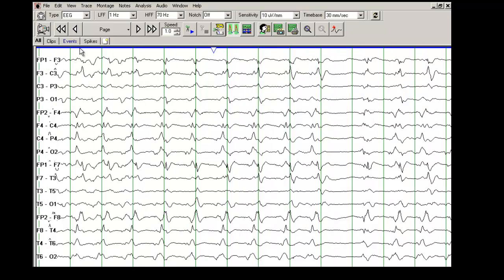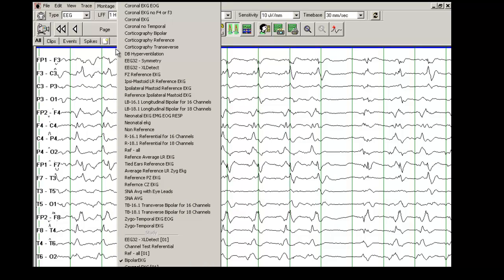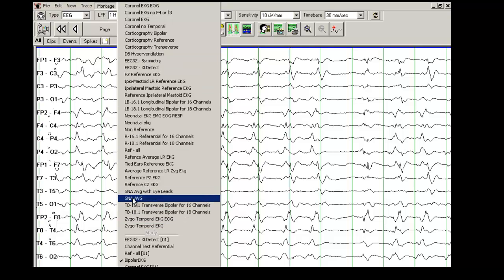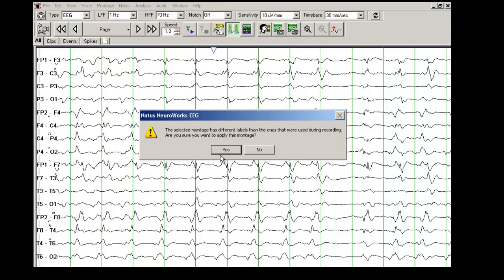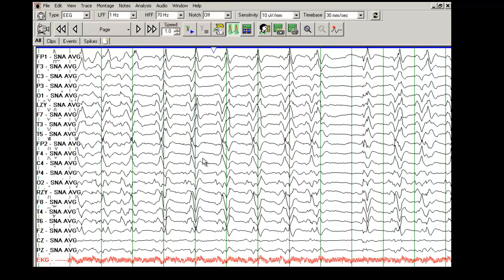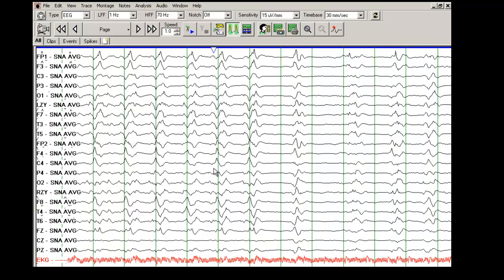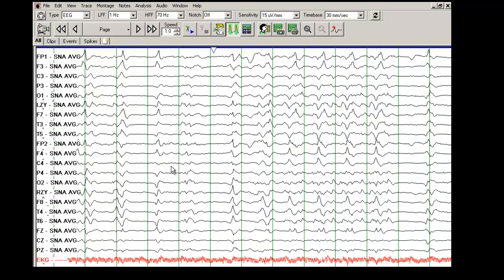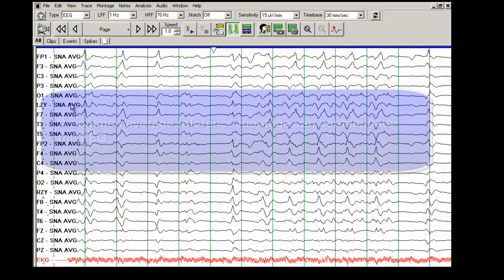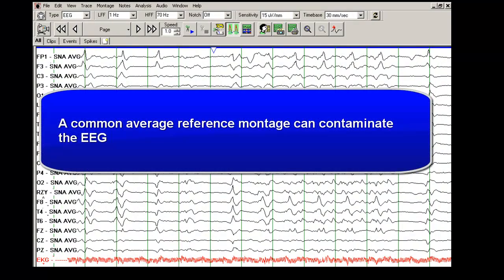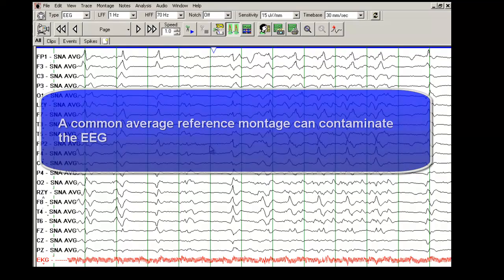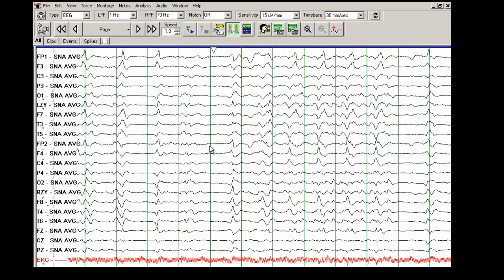Let me change the montage here. So I will go to an average reference montage. When I go to the average reference montage, I will reduce the amplitude here. And let's keep looking at it. There is some degree of contamination because this is an average montage. And negativity from one hemisphere will create a relative positivity when you are using an average reference montage.